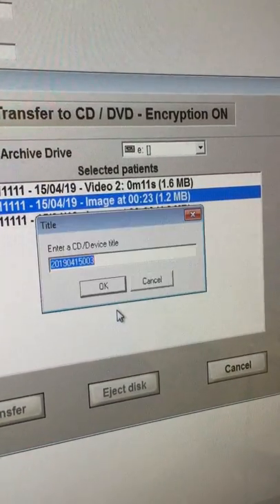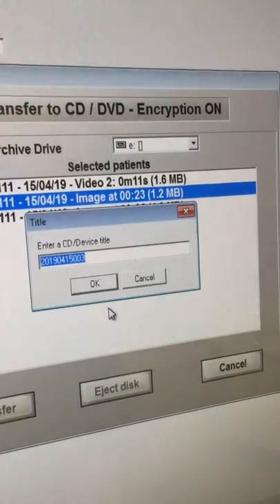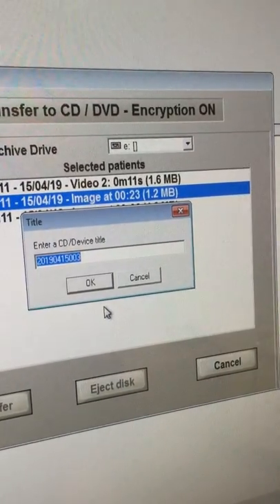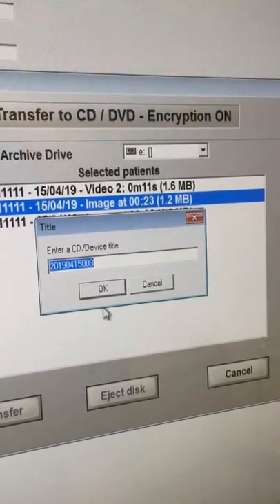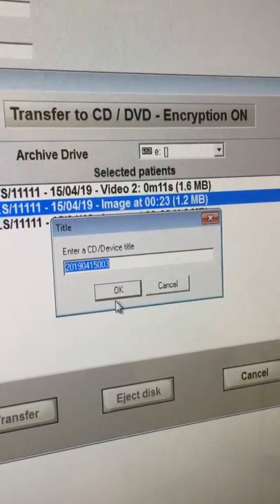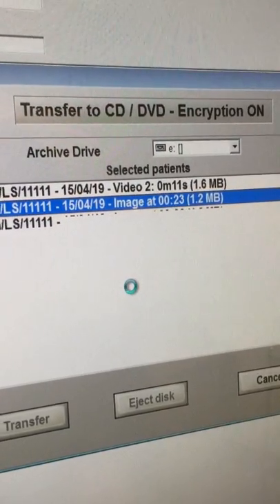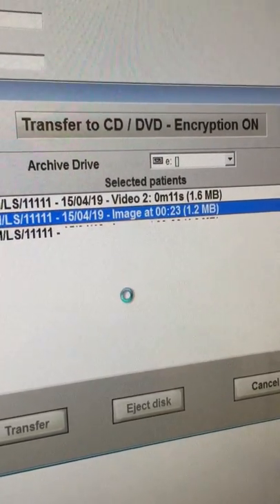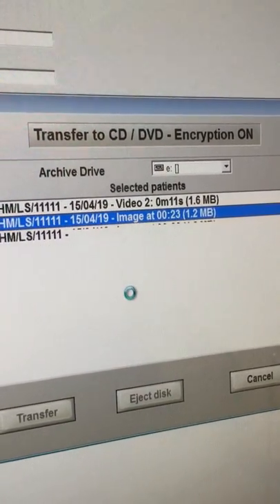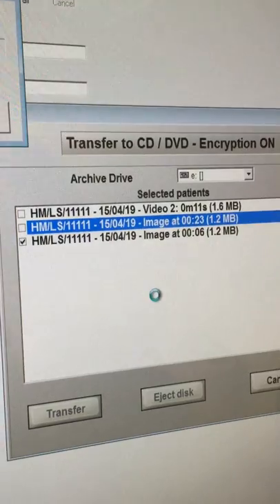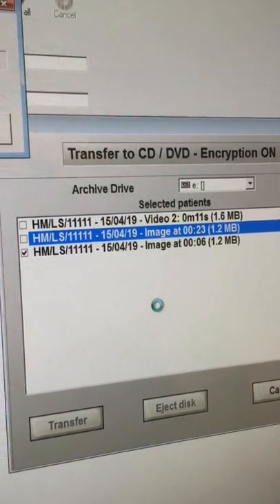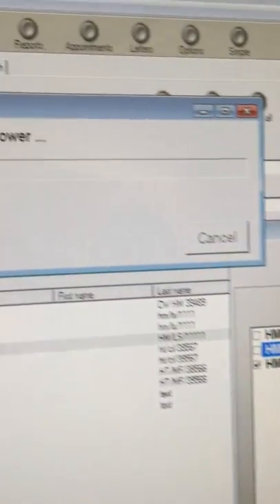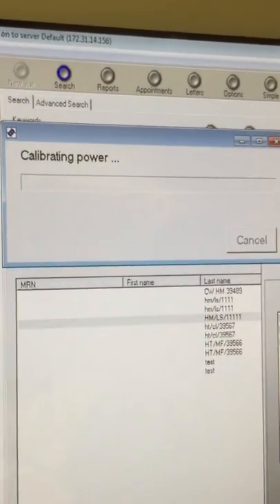You will see then that the pop-up screen asks you for a title and you are simply going to click OK. At this point the transfer should commence and you can see at the top it says burning disc and calibrating.